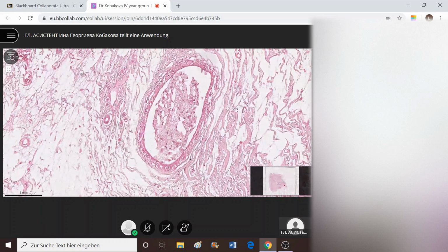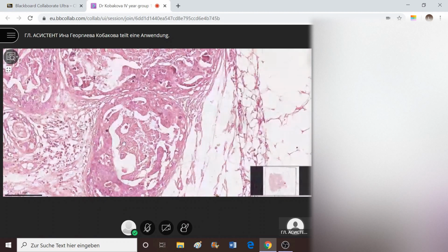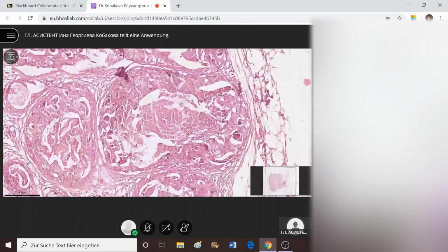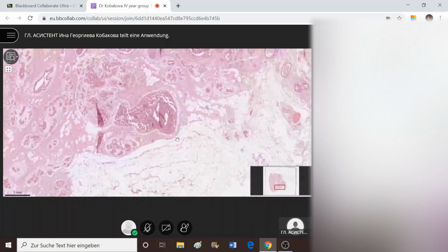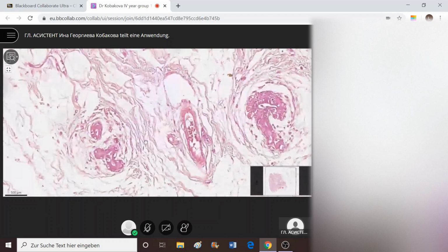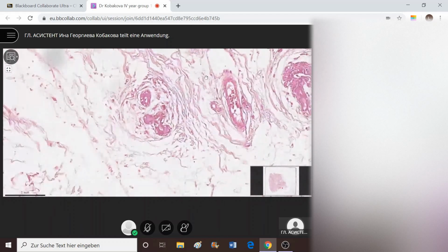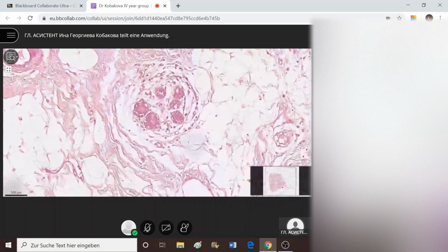And yes, this is already a tumor. Most of the slide is tumor, and others are with severe dysplasia. Here, there's some, no, these are not benign. Again, starting to be either with apocrine metaplasia or with already change into tumor cells.